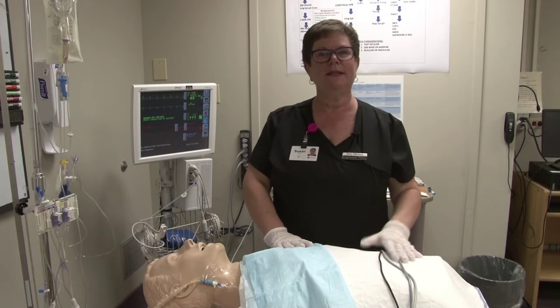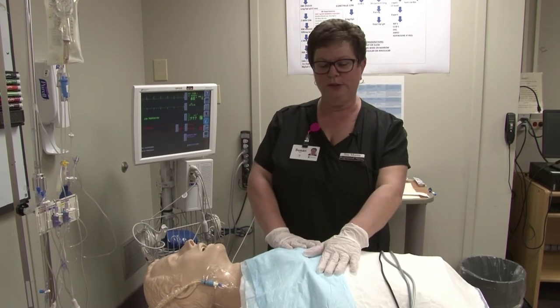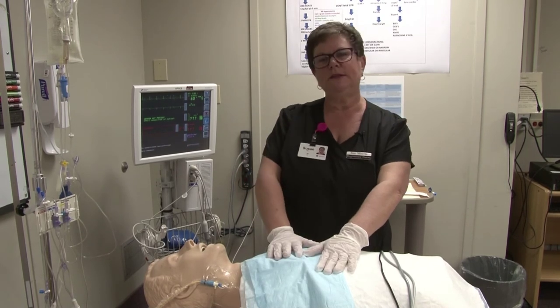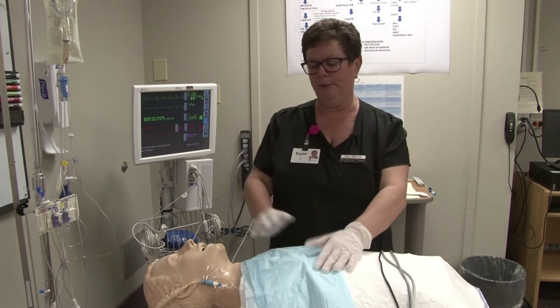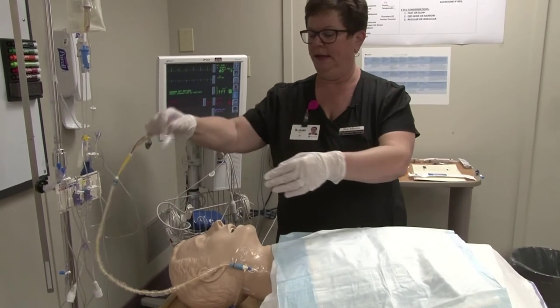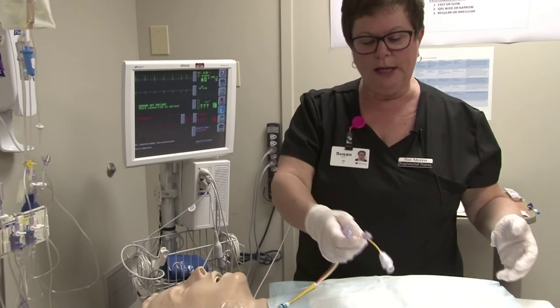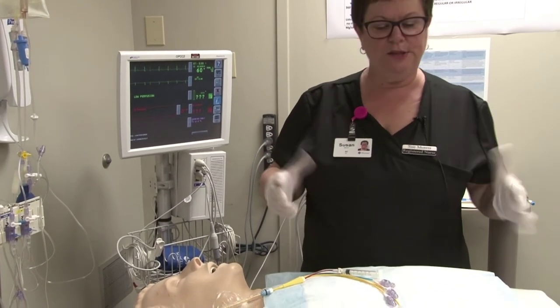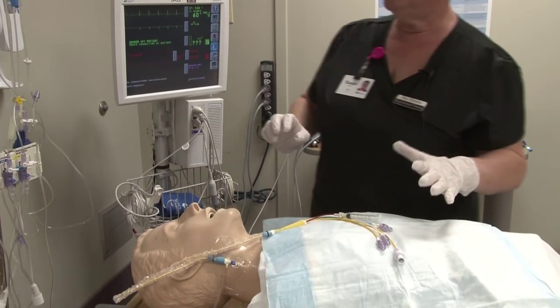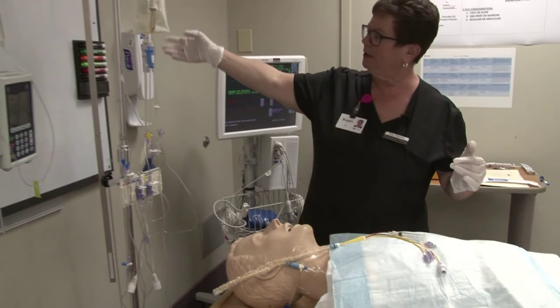Good morning, my name is Sue Morris. I'm the clinical nurse educator at the New Brunswick Heart Center. Today we are going to do a demonstration of how to set up a pulmonary artery catheter that has been inserted in our cardiac catheterization lab. When the patient arrives, our lab is good at calling us and letting us know a patient with a pulmonary artery catheter would be arriving, so prior to arrival you need to have a few things ready.